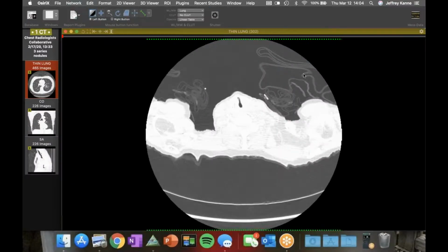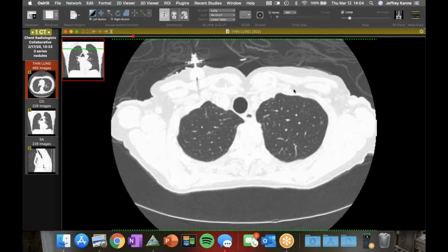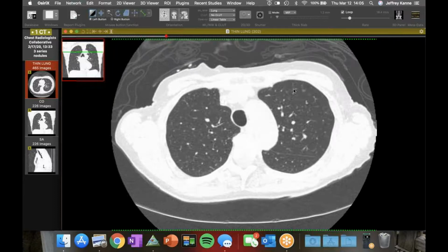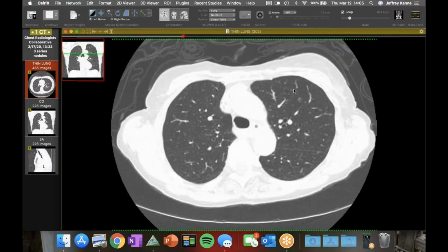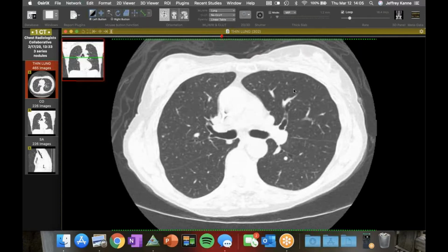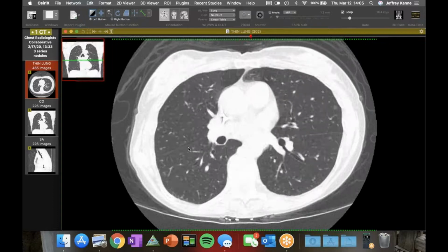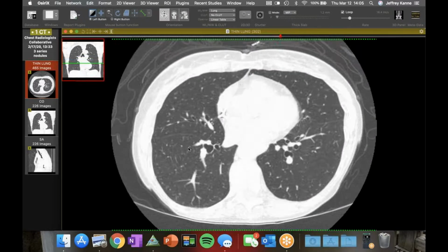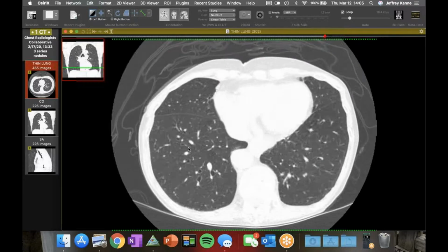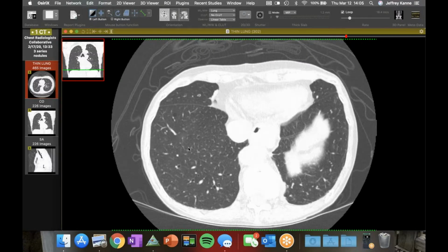A couple times ago. So I saw this case. This was scheduled as a lung nodule follow-up. And you can see this patient has all these tiny little nodules, like these little ones here. And I went back to an old abdominal CT from 6 years earlier, and the ones in the lung bases were there, and they're exactly the same.